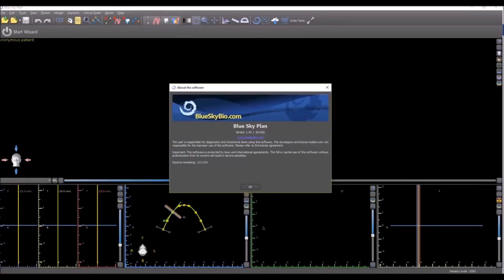Some new improvements and functionality in version 3.40 of the BlueSky plan software.